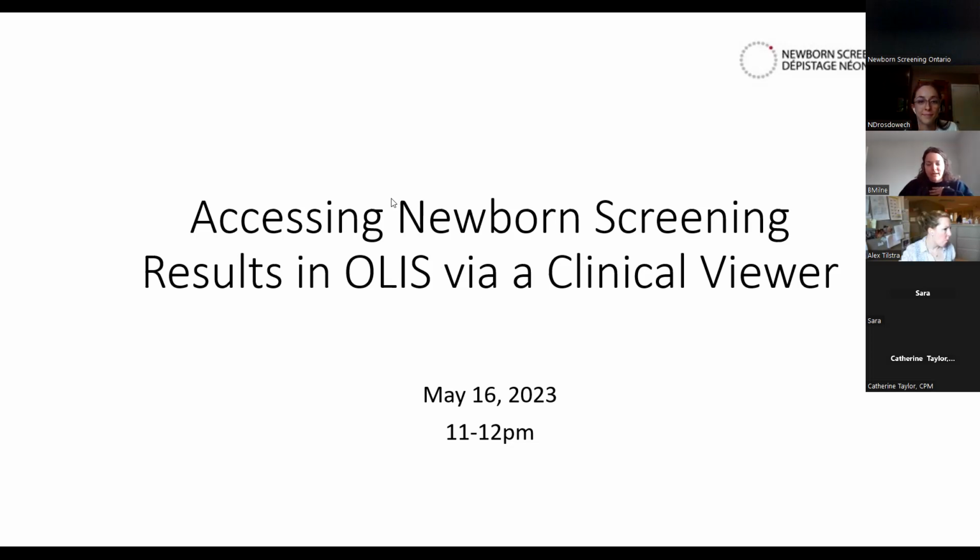So I'm Bailey and I'm a project coordinator at Newborn Screening Ontario. And I'm here with Nadine, who's a clinical content specialist at NSO as well. And Dallas has joined us from the eHealth Ontario team. So the purpose of our webinar today is to discuss OLIS and how you can access newborn screening results through OLIS via a clinical viewer. So I'll be talking about what OLIS is, why we're promoting it, and then I'll hand it over to Nadine.